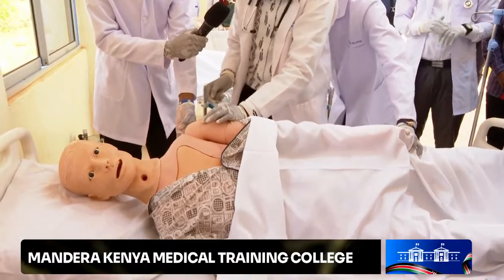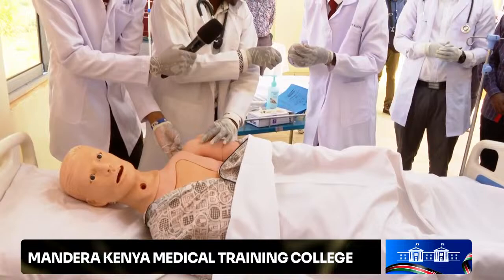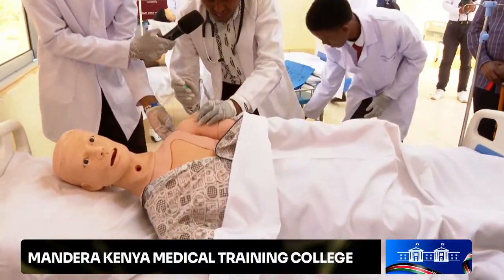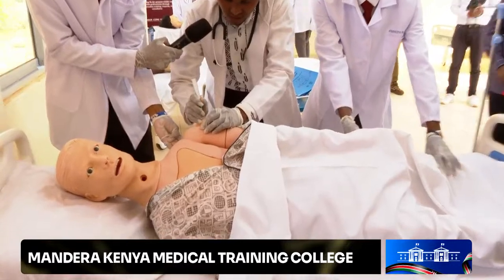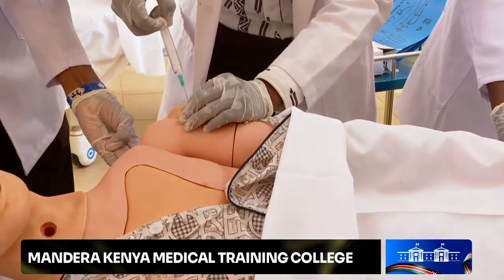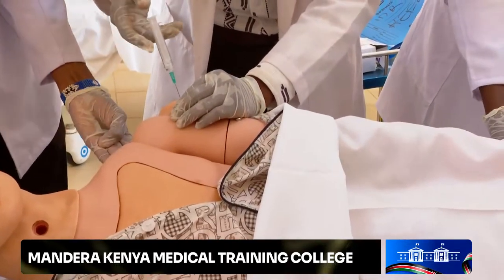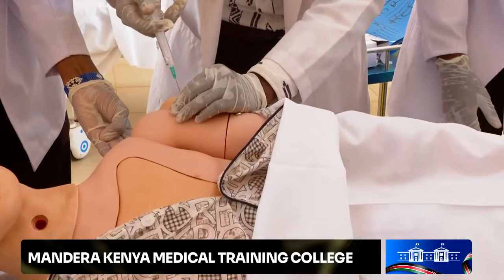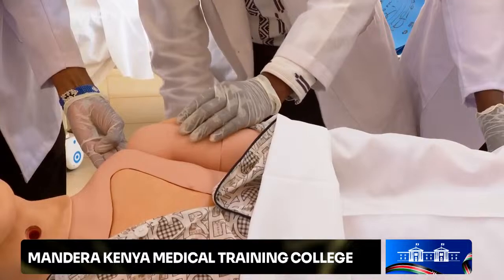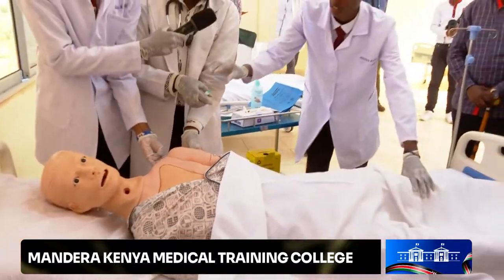In this case, you pinch the skin at an angle of 90 degrees. That's where you inject. You aspirate. For intramuscular, you don't want blood to flow in. So you expect that there is no blood flow here, and then you inject at an angle of 90 degrees. You pinch so that it will not bleed. Very good. Thank you.